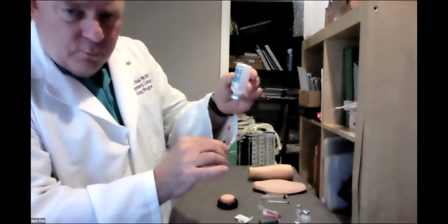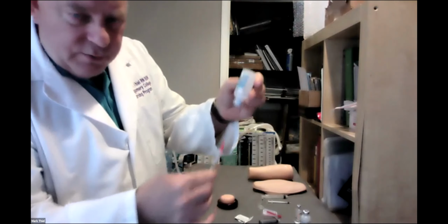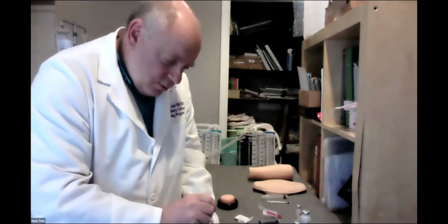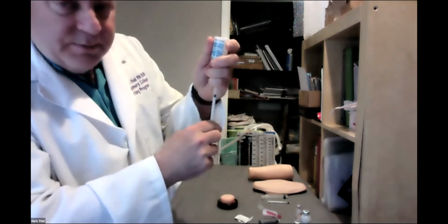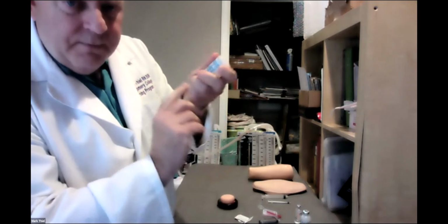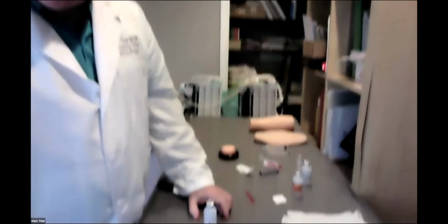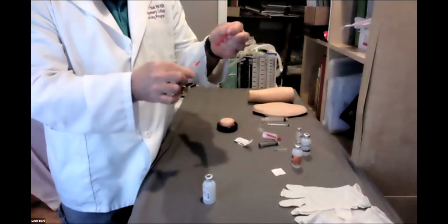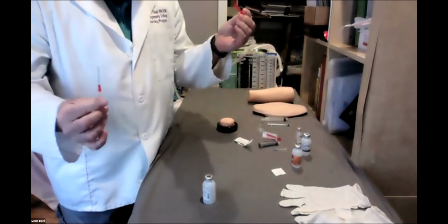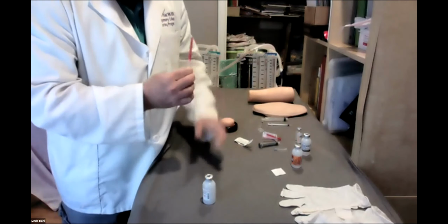Wow, right in my hand. Ooh, poke. So we don't do this. We put it down, inject, do everything that I just described to draw my med, withdraw. Nurse safety, we don't recap like this. Poke your hand again. We scoop. We scoop our needle.